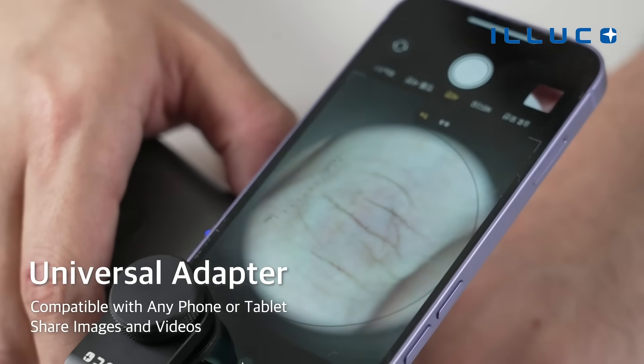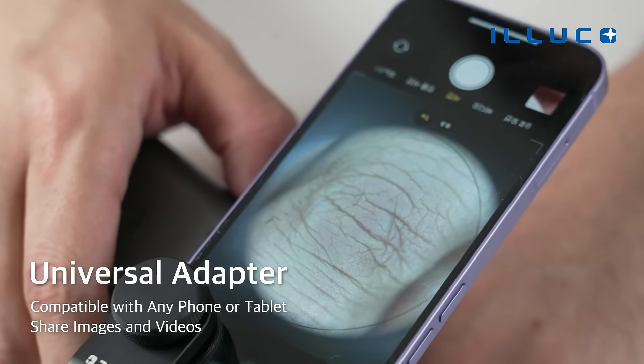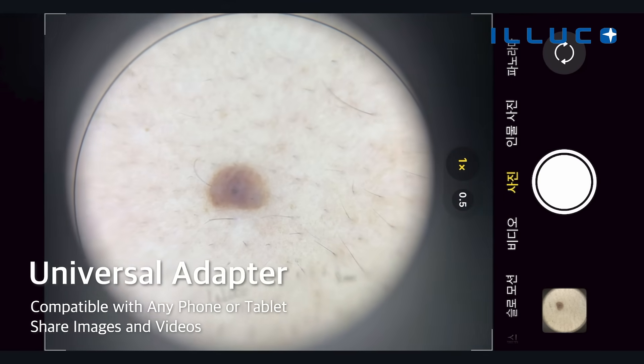And NVSA. You can directly observe the object through the lens with the naked eye, or alternatively, attach a universal adapter to capture and share images and videos.